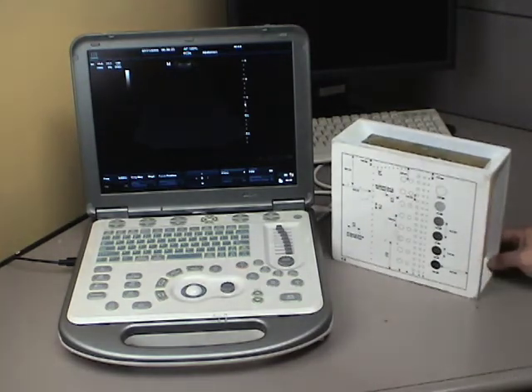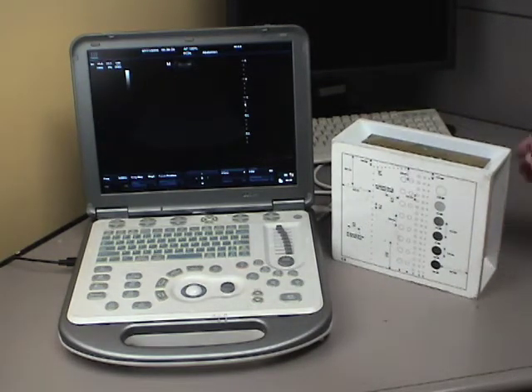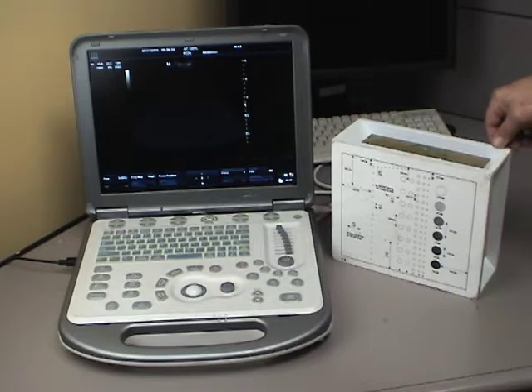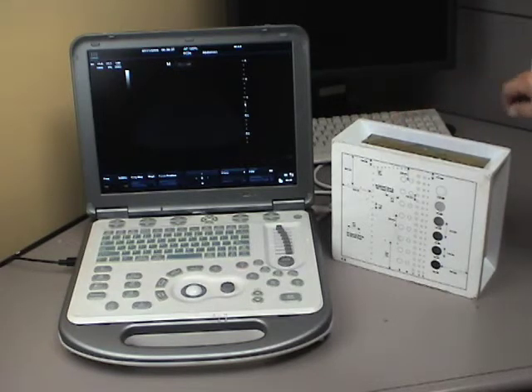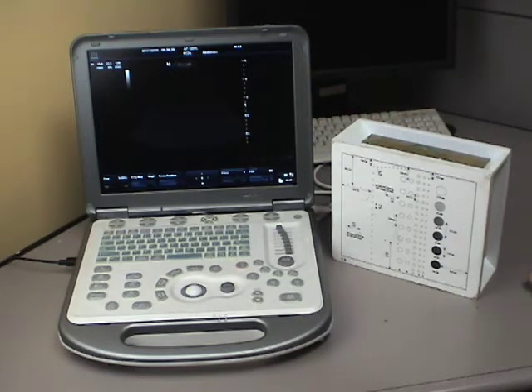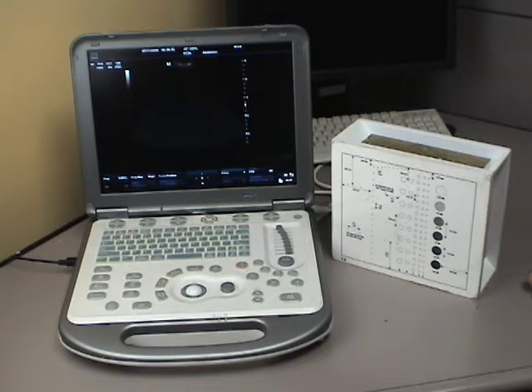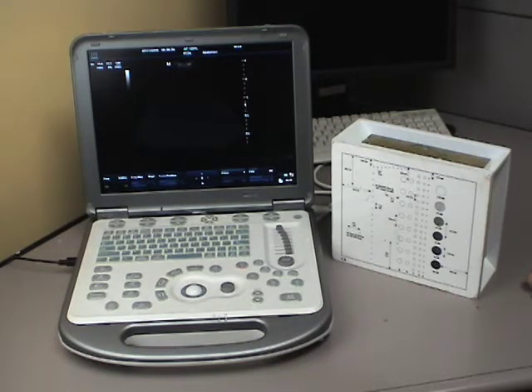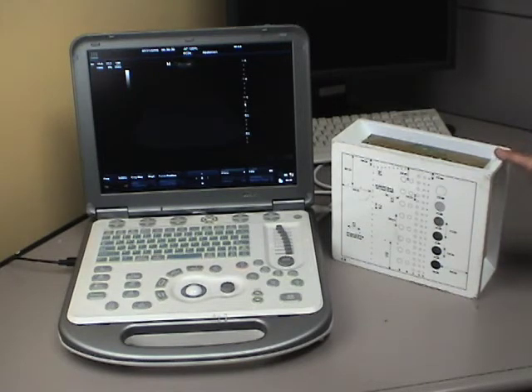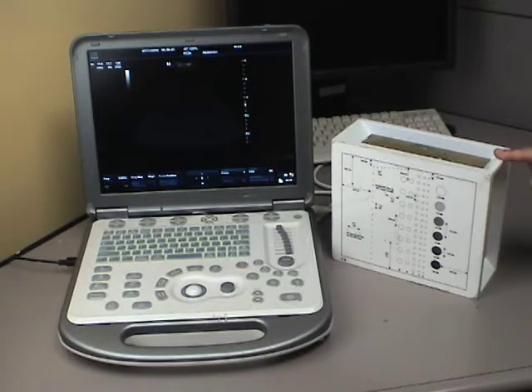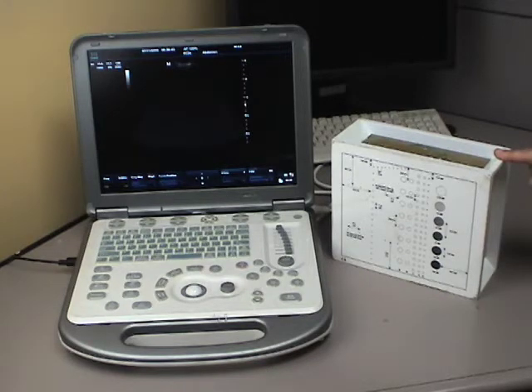And the second most common phantom is probably the tissue equivalency phantom that is actually filled inside with a gelatin type material that, if you cut it open and look, has the appearance of being filled with graphite particles so that it actually mimics the appearance of a liver when you're doing an exam on it.